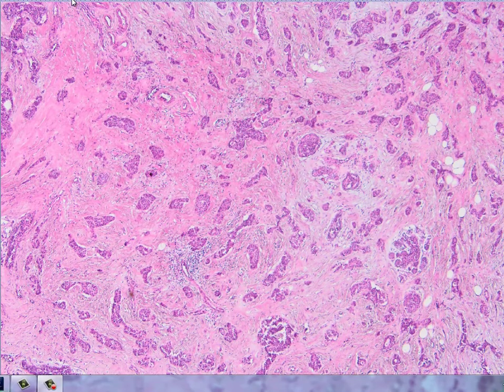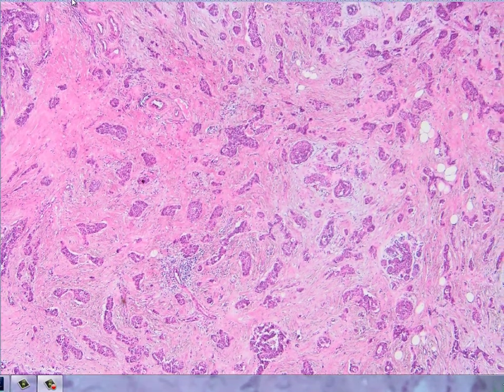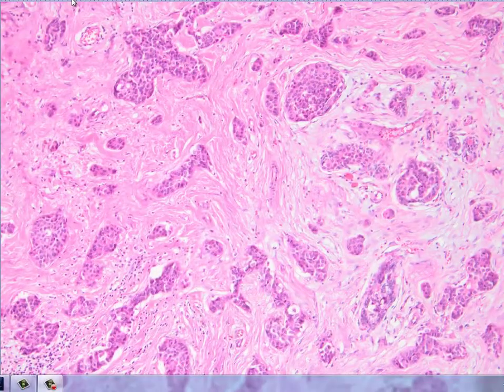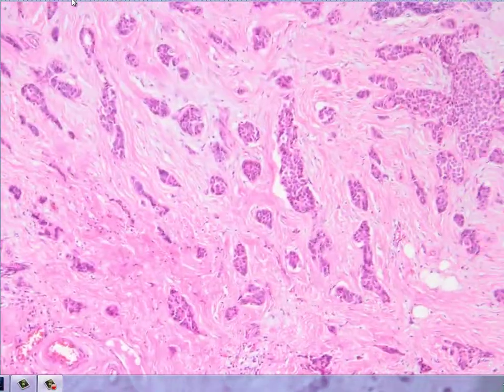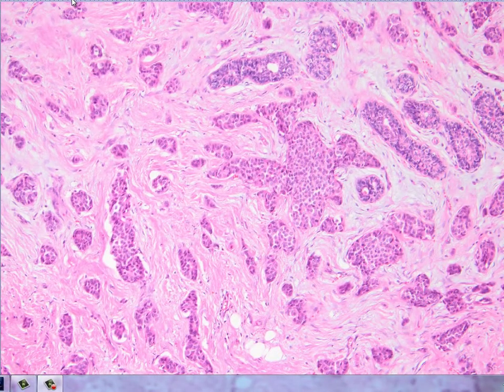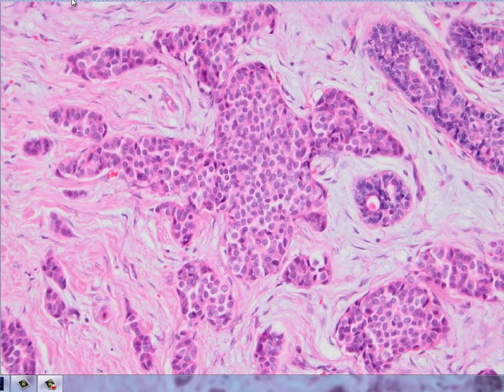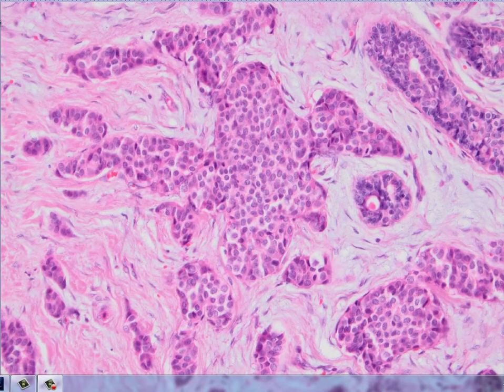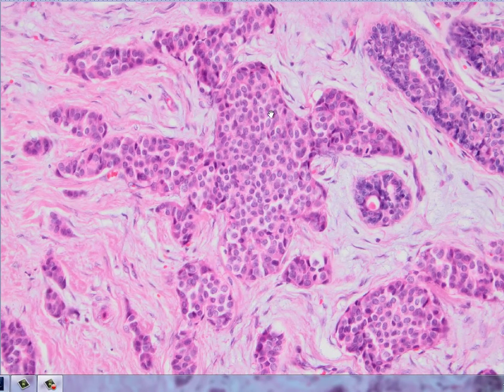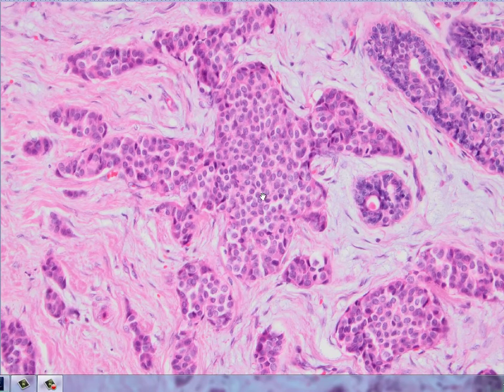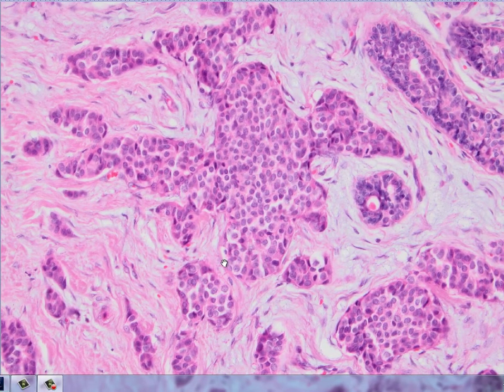Moving to the high power, the tumor looks monotonous and bland. There is no pleomorphism and we can grade this tumor as a grade one tumor. It also has nuclear features like salt and pepper chromatin, and there are no nucleoli.